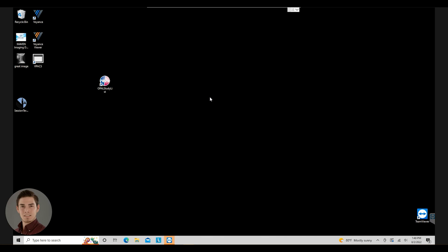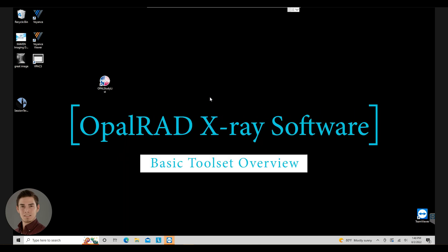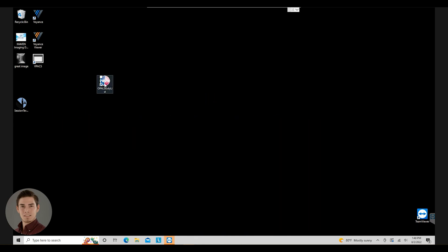Hi there and welcome. My name is Marcos with Maven Imaging. I'm one of the support engineers here. Today we're going to be going over the OpalRad software and the basic tool set of that system.